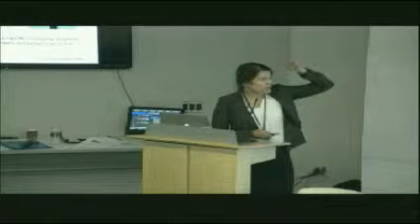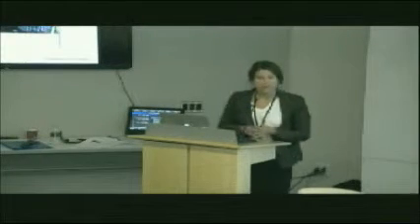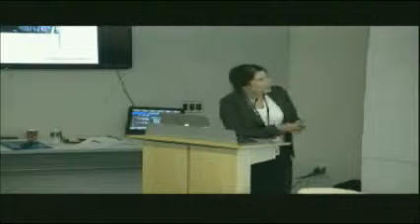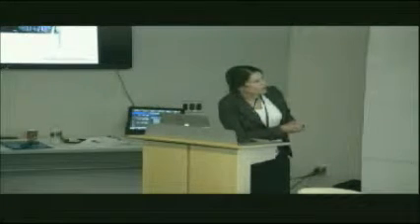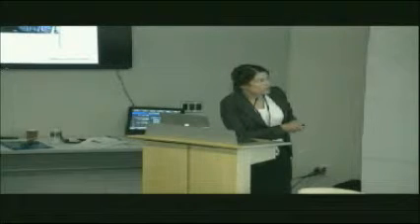There's a part of our brain that has all of the motor signals that go down the spinal cord. So you put it there. You elicit this magnetic field, which causes the neurons in your brain to fire. And these can be excitatory or inhibitory. I'm showing here an example. This is the coil that we put on the back of a person's brain. As you turn it on, there's a spread of that magnetic field through your brain.